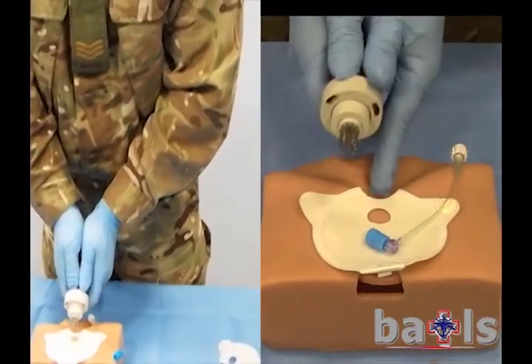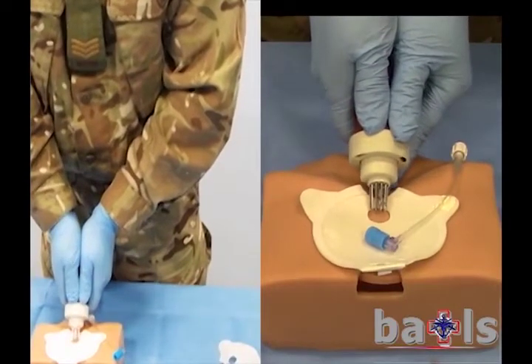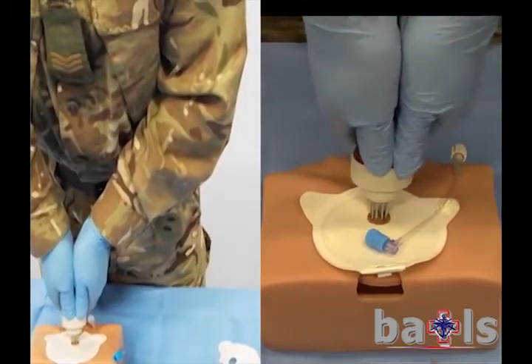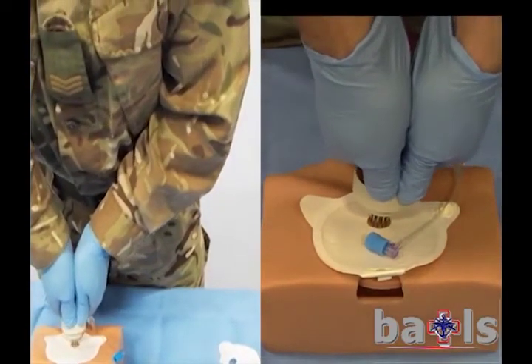Using a two-handed golfer's grip, keeping the elbows locked, apply firm pressure through all nine needles, using your own body weight if required.